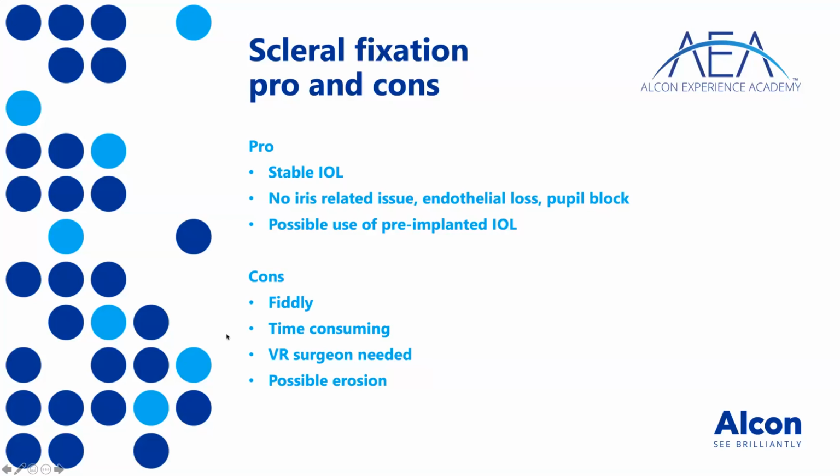What are the problems with this technique? It's fiddly. There is nothing to say. If you go online and you Google videos, you see all these fantastic videos of 5 minutes. I promise you, these are very, very edited. It's very possible that the haptic snaps. It's very possible that the haptic, once you have created the flange, comes back inside the eye again. It's never so easy to insert the haptic inside the needle.